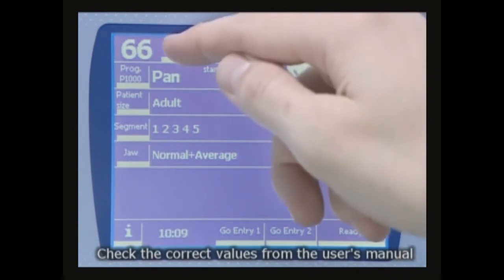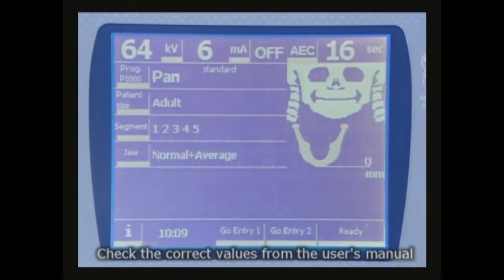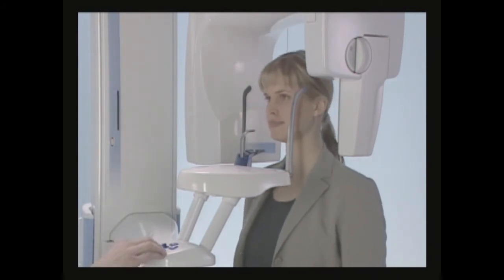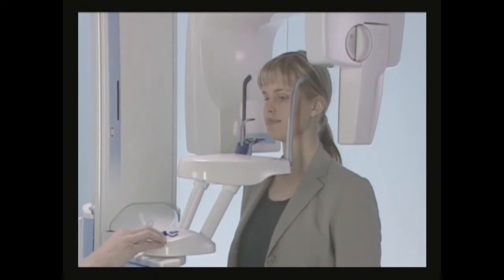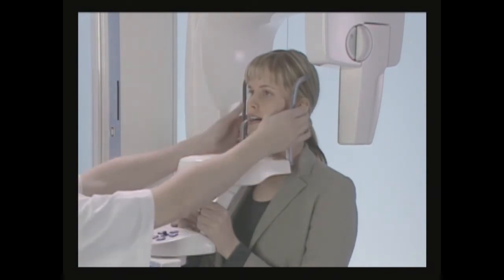Select the correct exposure parameters for the patient. Guide the patient to the unit so that she is facing the chin rest. Adjust the chin rest approximately to the height of her chin. Ask the patient to step forward, grasp the patient handles, stretch up and bite the bite piece.